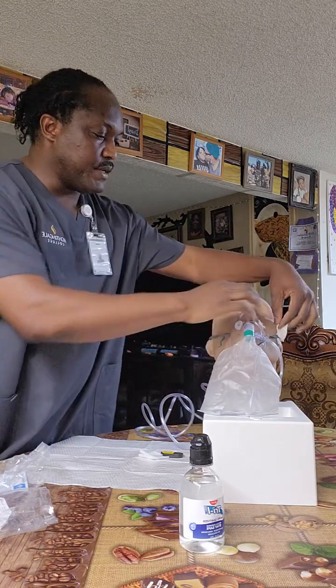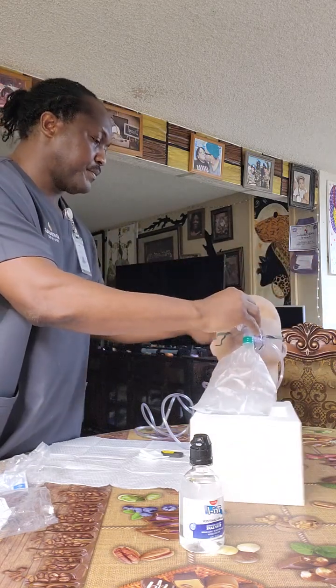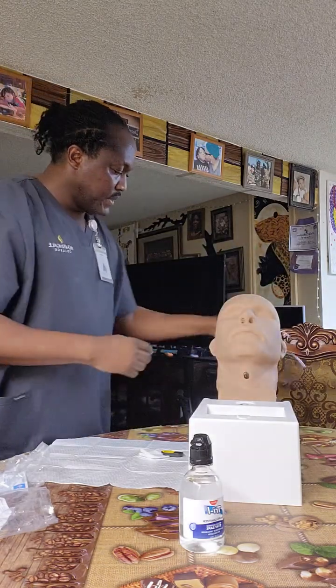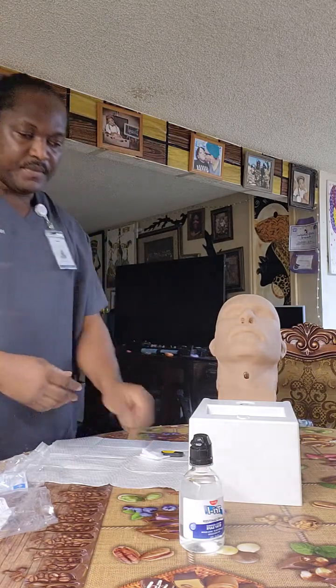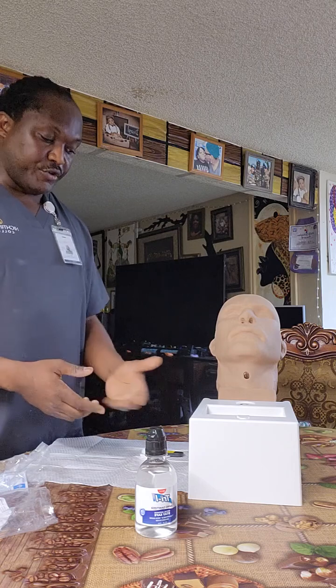I'll begin by removing the padding. Discard it properly. Perform hand hygiene. And then I'll exit to go and document whatever I did and how the patient responded to the treatment or the oxygen flow, ensuring that I give him privacy at the same time. And that brings me to the end.